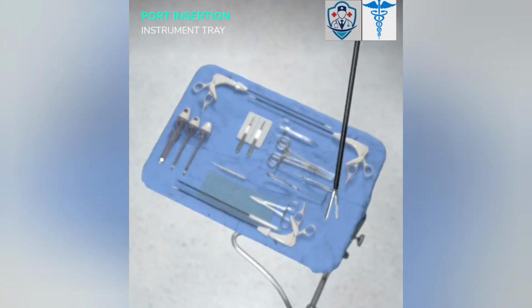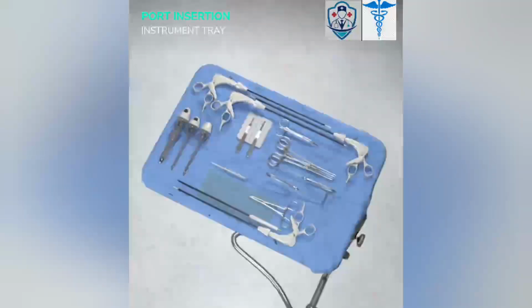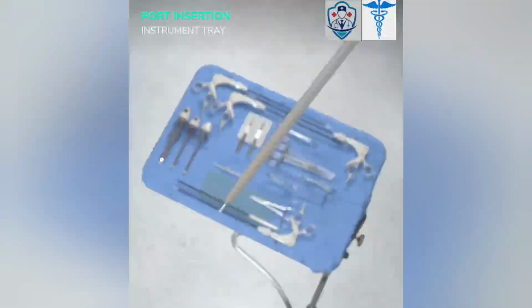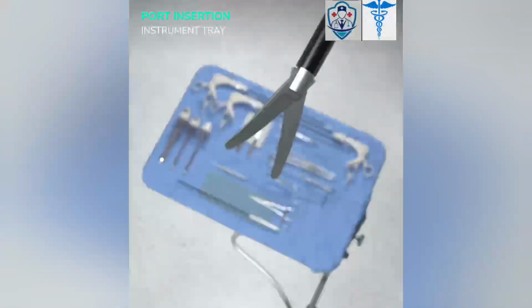The laparoscopic clip applicator is used to introduce and close a clip around a vessel. This instrument can be used to ligate the appendiceal artery during mesoappendix dissection or to ligate the appendix at the base. Loops can be used to ligate the appendix at the base. The laparoscopic scissors are used to divide the appendix at the base between the loops.